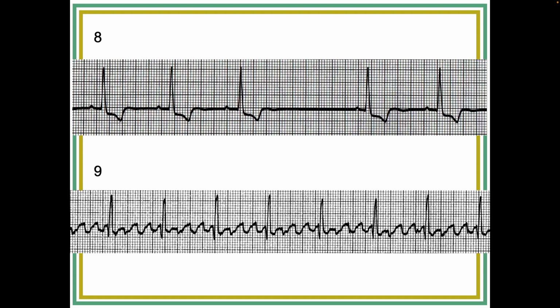No, it can't possibly, because it's being depolarized 300 times a minute. When these reentry pathways establish themselves, they're very regular and very rapid. So this electrical impulse is just going round and round and round the atria. Every time it goes around, it depolarizes the atria, so there's no possible way for the atria to contract. So in the very basic definition of a P wave, it is a P wave, but more specified because it is an atrial depolarization, but specifically a flutter.